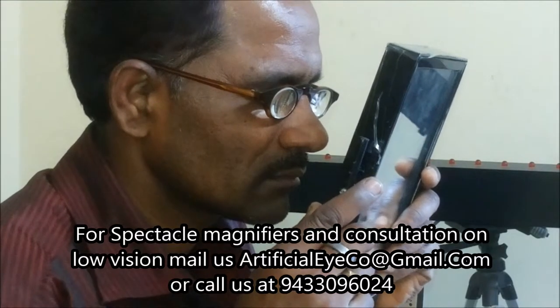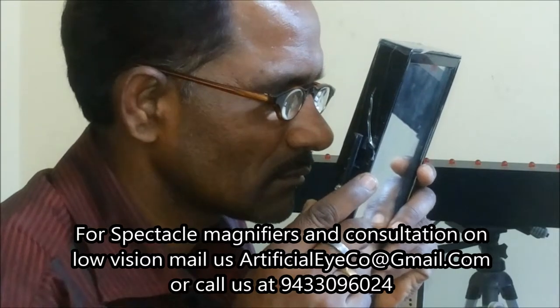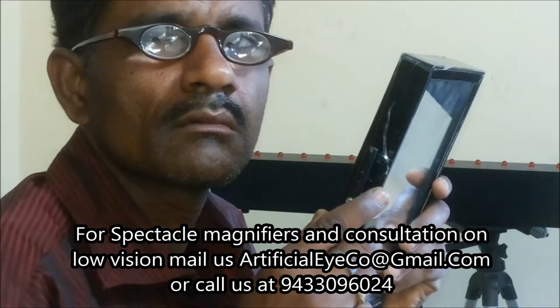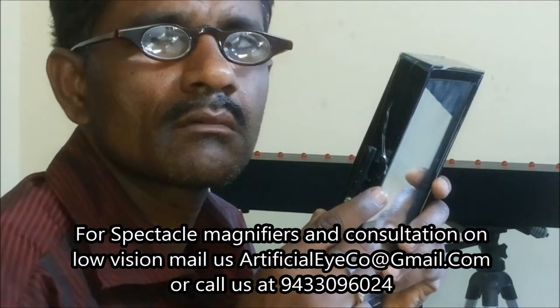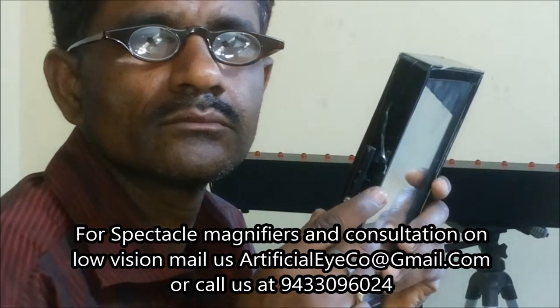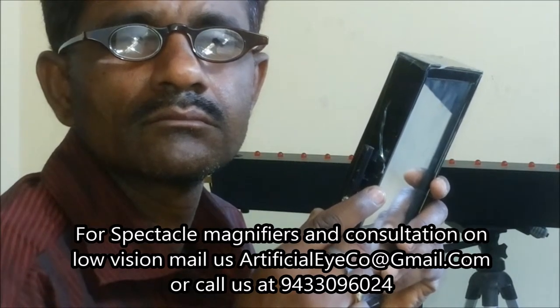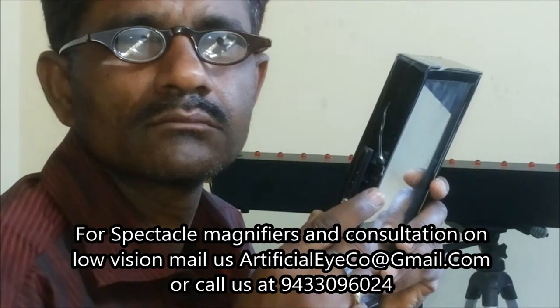Patients want to wear it because it looks like specs — it looks more like a normal frame. But since the glasses have high magnification, you cannot see the eye of the patient very clearly. Still, the patient wants to wear this low vision magnifier.